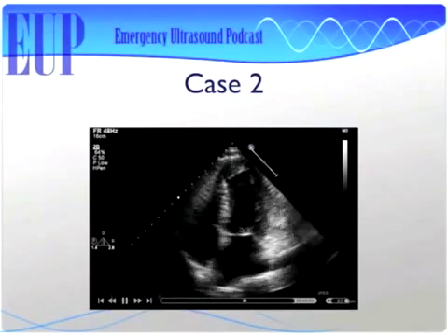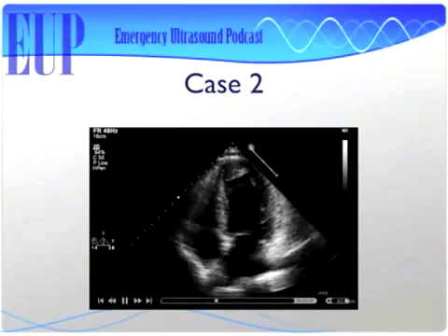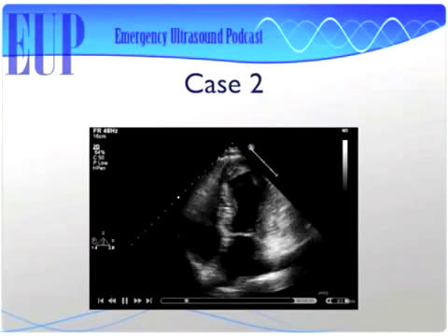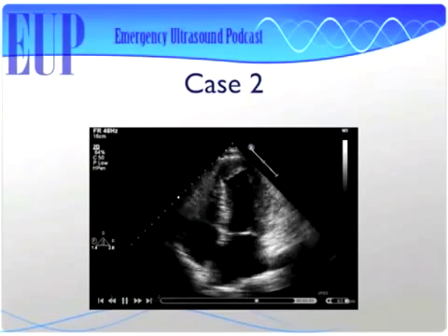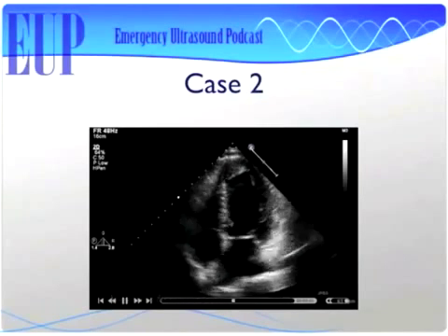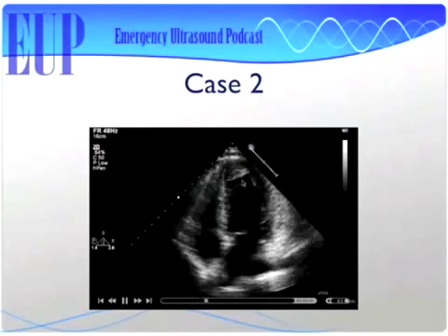So we could either call the cardiologist and say all that, or we could say, hi, this is Dr. Dawson. I'm calling to tell you that I've got a patient with an LAD lesion based on bedside echo. All right, awesome. So this looks like an LAD lesion based on the fact that the apex is what's really down. Now, there might be a little bit of hypokinesis down on this side, which would be our circumflex distribution. But man, this basal septum here, which is RCA, looks awesome. It's getting after it. Yeah, RCA is kicking butt. But LAD is way down and not looking happy. What's that funkiness up in there?